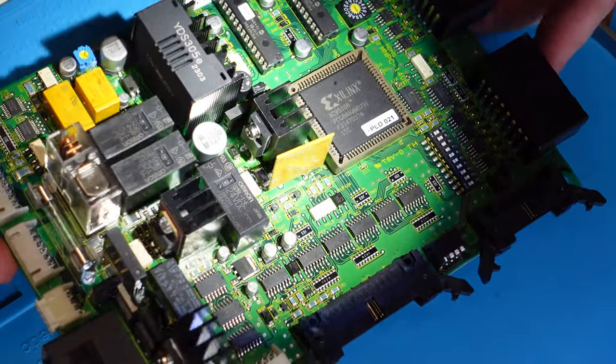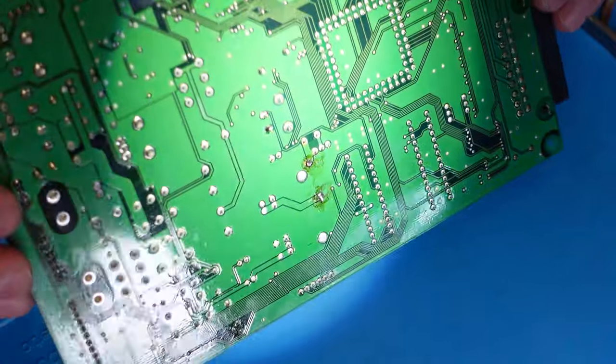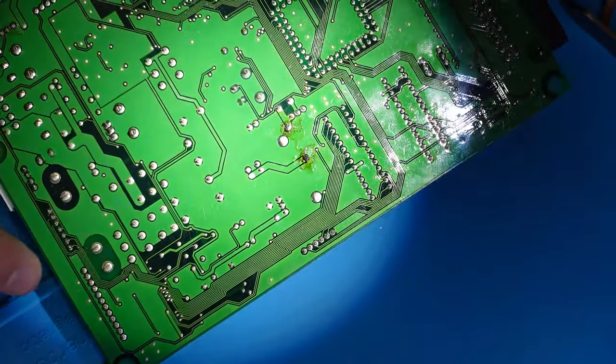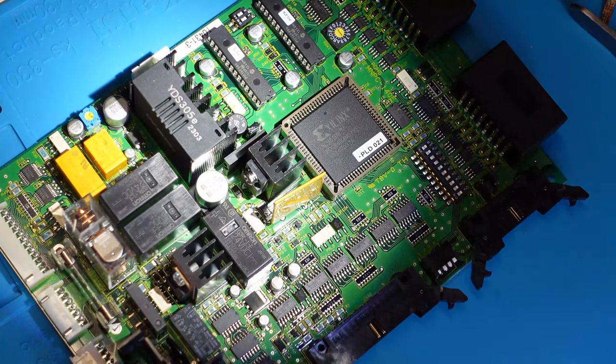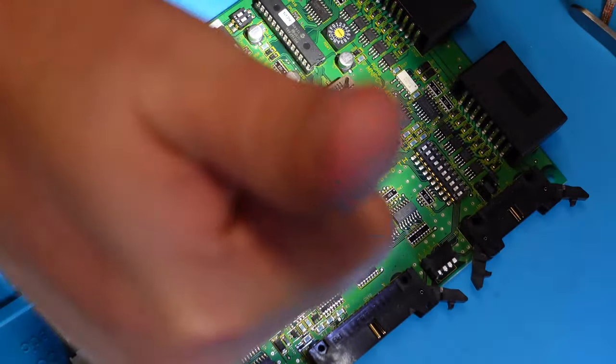Not so bad. If I wasn't sitting here in a very hot room, it probably would be a wee bit better. I got a little bit of flux to clean up here on the underside, but man, other than that, it is not that hard of a repair job. And it looks like all the traces are connected, verified under the microscope, and I think we are good to go.